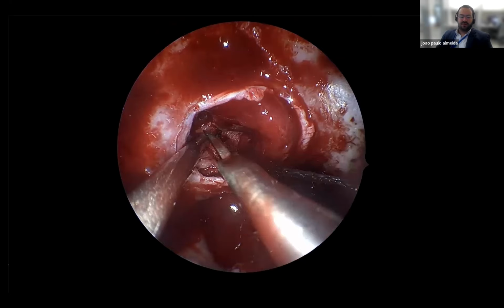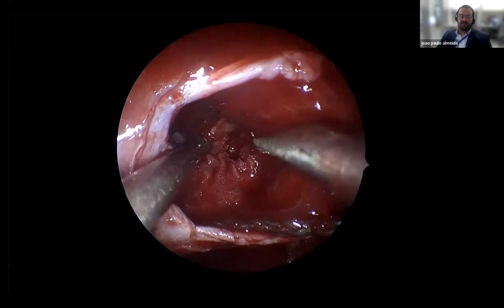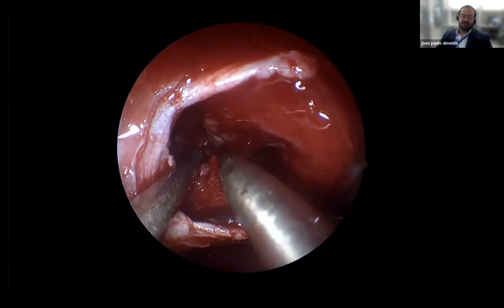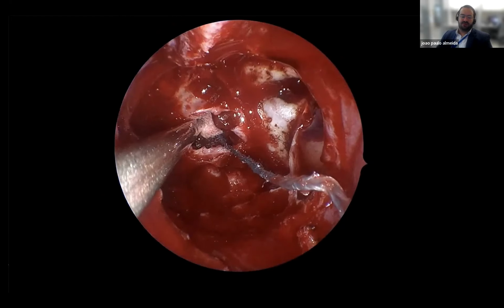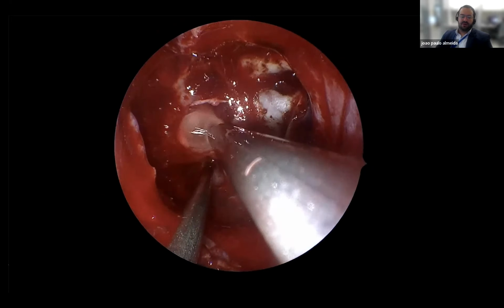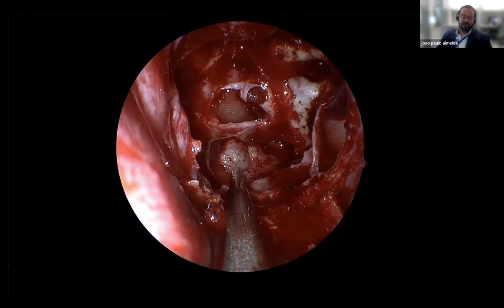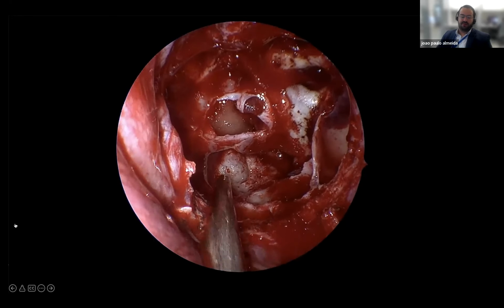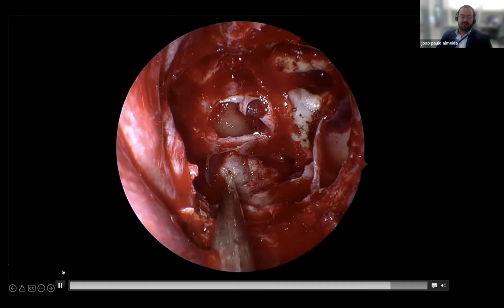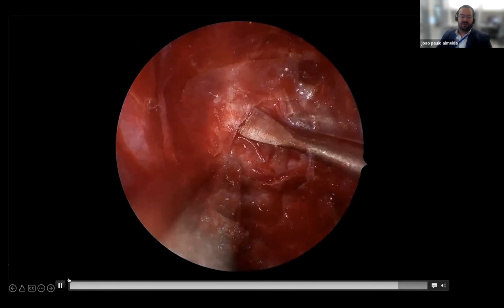So we're gonna go and you're gonna mobilize, and I actually spent quite an amount of time working the gland, trying to maximize the resection of this tumor using sharp dissection, as you see there, rather than the curettes, in order to not only remove the tumor completely, but to remove the tumor completely while preserving the anatomy and therefore hopefully the function of the normal pituitary gland. Because remember, she's only 21 years old, so hopefully she can go and get pregnant and everything else.